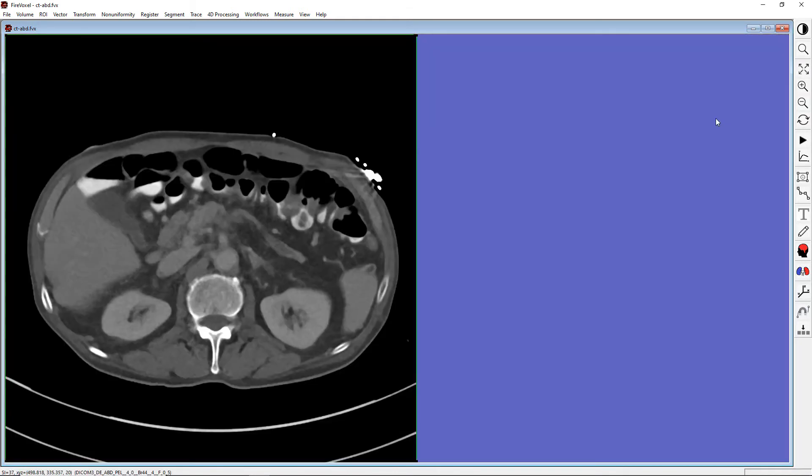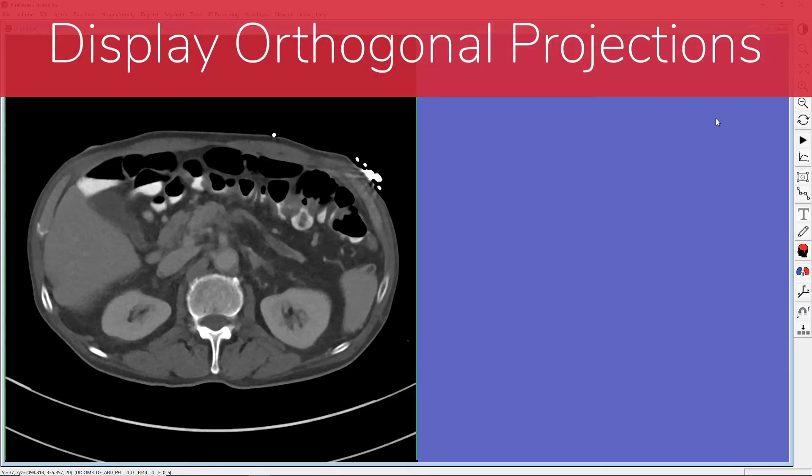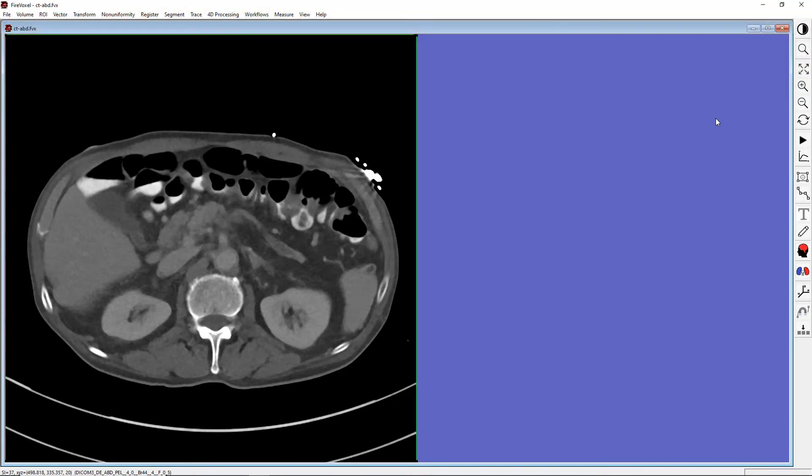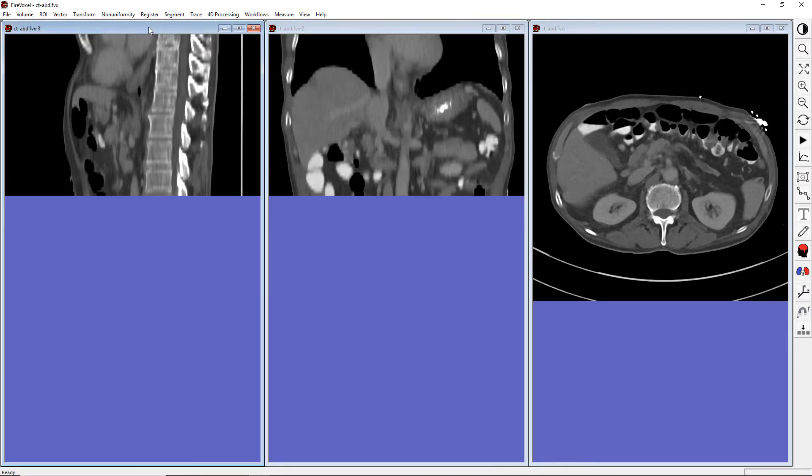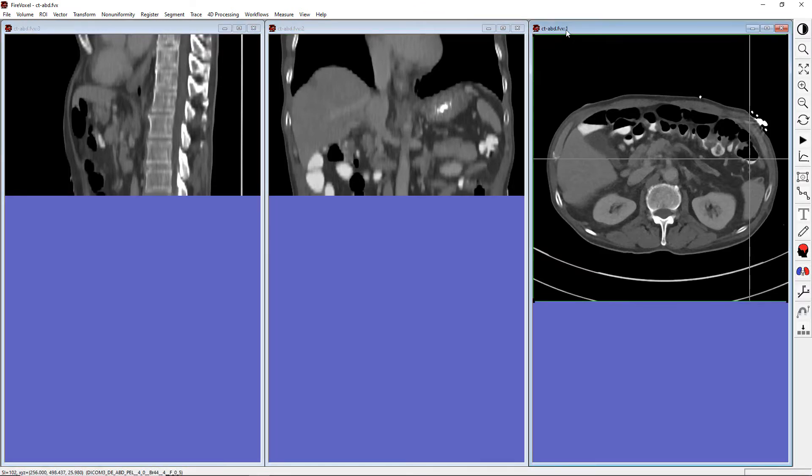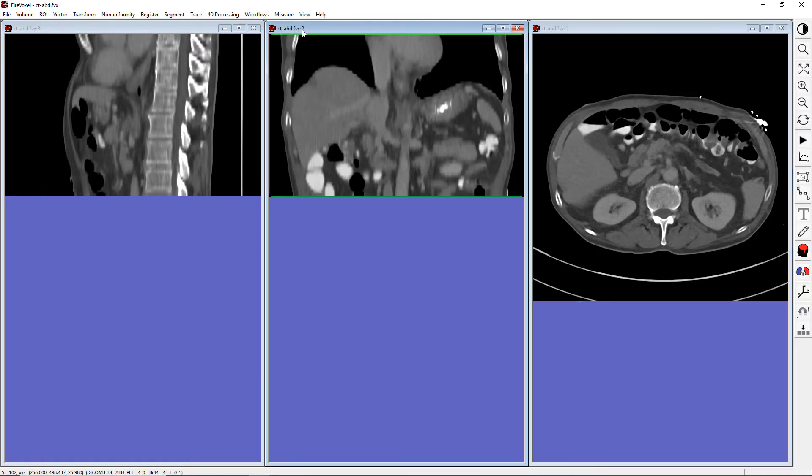Often, we want to view our images not just as they were acquired, but in other orientations as well. Here we have axial images. Let's use the Display Orthogonal Projections tool on the main toolbar with the icon with X, Y, and Z axes. This will open two new document windows with the coronal and sagittal views. The window with the original image will be labeled number 1, and the orthogonal projections will be labeled 2 and 3.